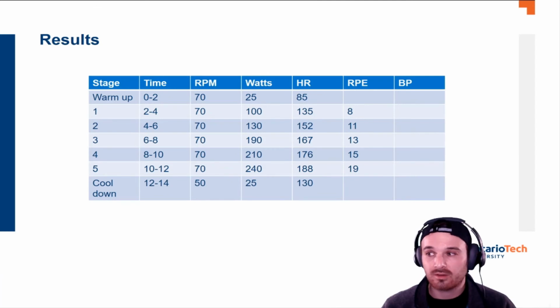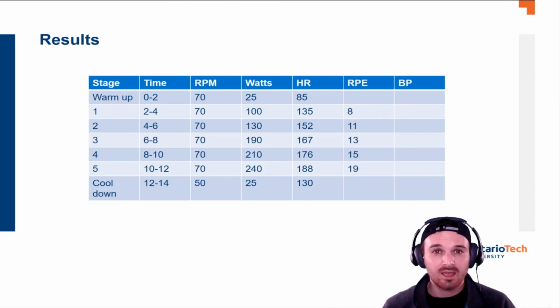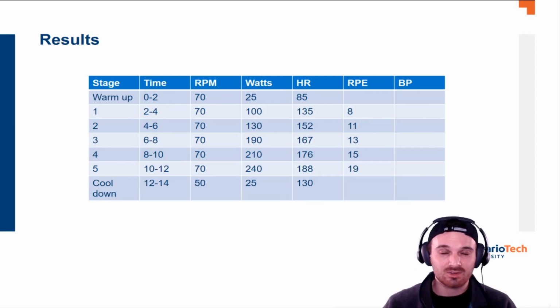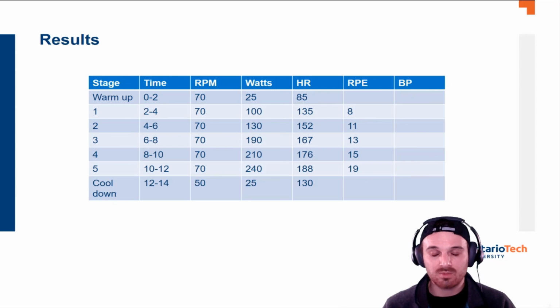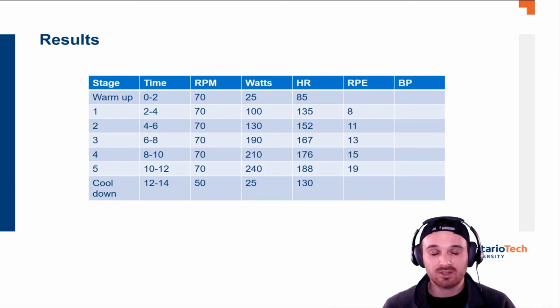I guess I'll make that a little bit bigger for 1 second, but that is how to run an indirect test. Not much to it, and especially if you watch the direct test, you can see that there's way more going on. So practicing the indirect test and getting that down pat is really handy, especially when you start doing everything else. You can see that during the direct test, there's actually not that much more going on than during the indirect. You're just kind of watching the data a little bit more. There's a lot more setup beforehand, and again, making sure your data is good during a direct basically turns it into an indirect with a couple glances over at the computer screen, and then you have more accurate data after.